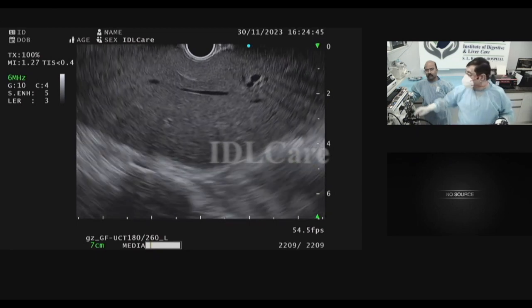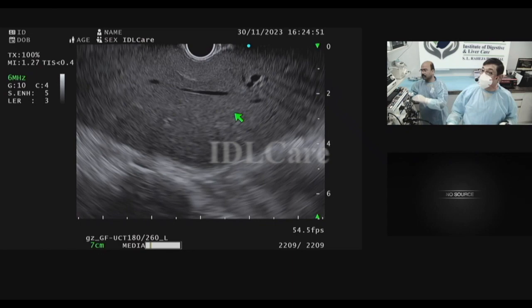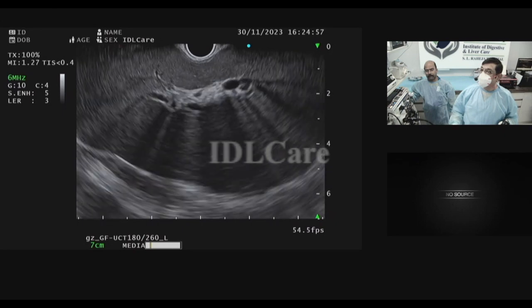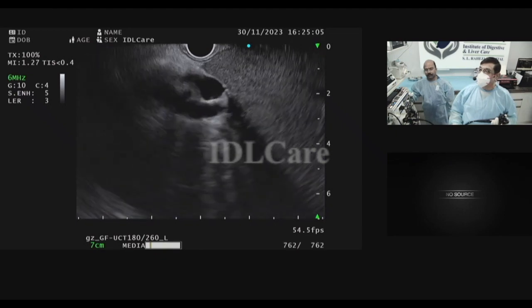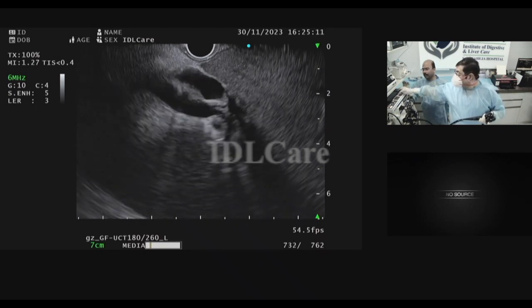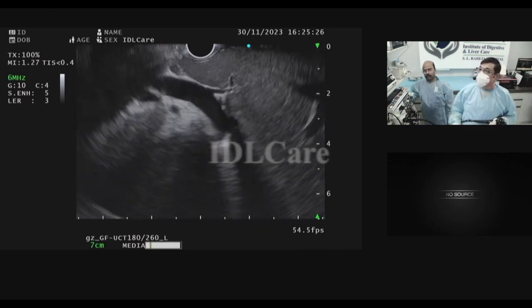This is the left hepatic vein. So segment 2 and segment 3, like I told you last time, turn clockwise, ligamentum teres, left portal vein, come back a little and then turn clockwise, freeze. So here is the CBD. Let's measure it. 0.3, mildly dilated. So you have portal vein, bile duct.